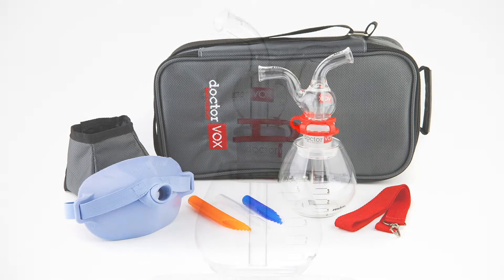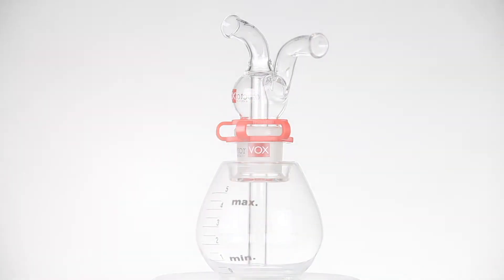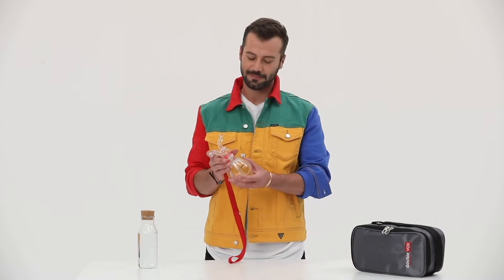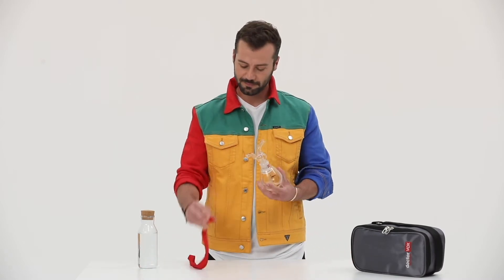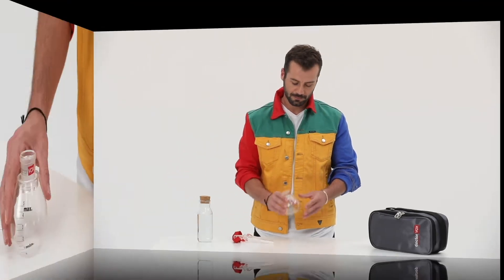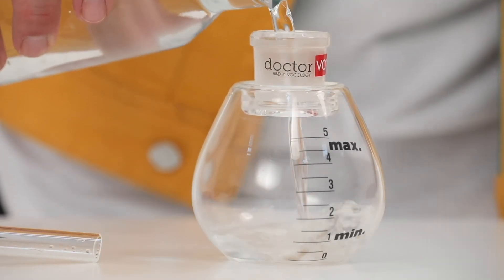Dr. Vox Apparatus is an essential product for all voice professionals. While singing therapy, it is very important to adjust the water level properly. Voice warm-up and beginner exercises should begin at a low water level. The Dr. Vox Apparatus container is filled with water to one or two centimeters.